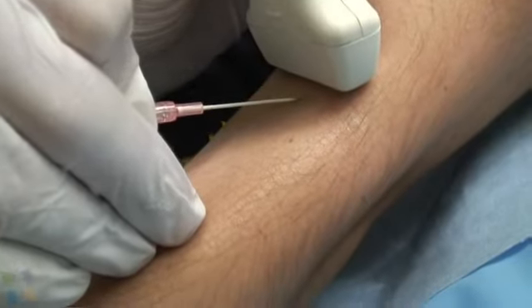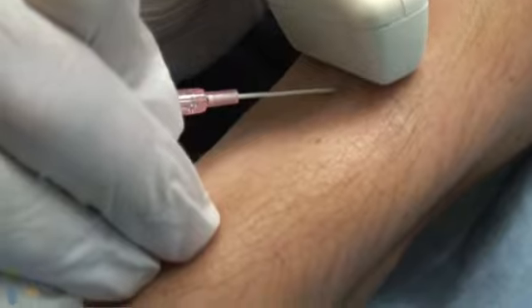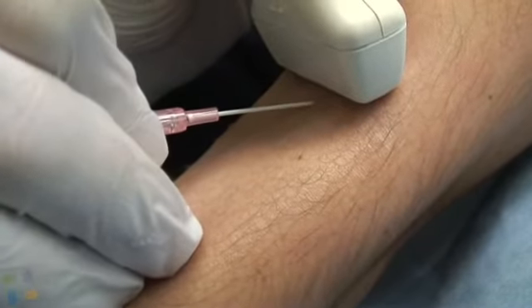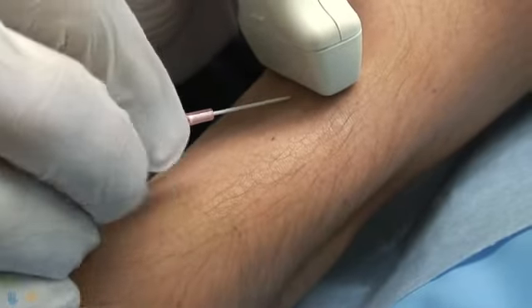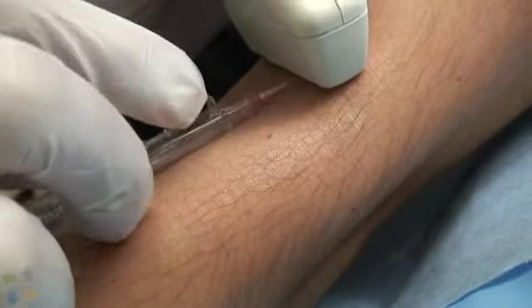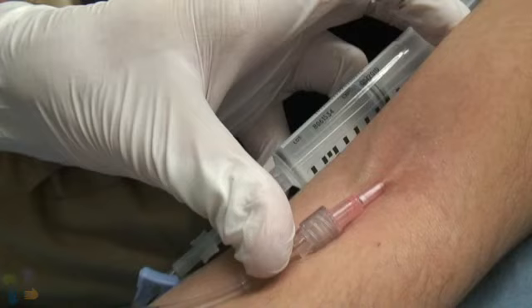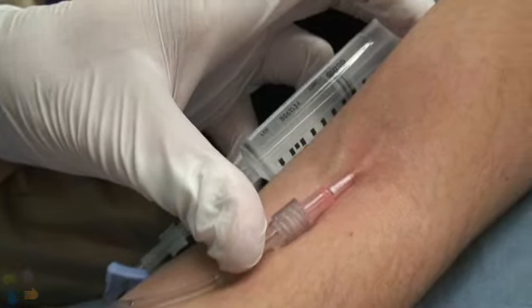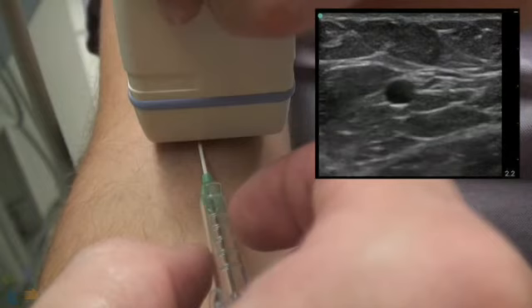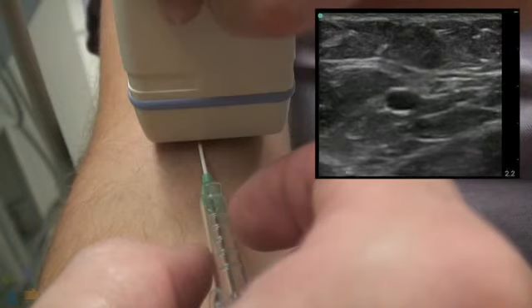When in position, puncture the vein with firm pressure and observe for the flash of blood in the needle. After the flash is seen, advance the needle 1 to 2 millimeters further, then advance the catheter over the needle. Draw blood, flush, and secure the line as with any peripheral IV. Be sure to wipe the site dry of ultrasound gel to facilitate securing the catheter in place. With minimal practice, ultrasound-guided IV placement can significantly improve your success in patients with difficult access.